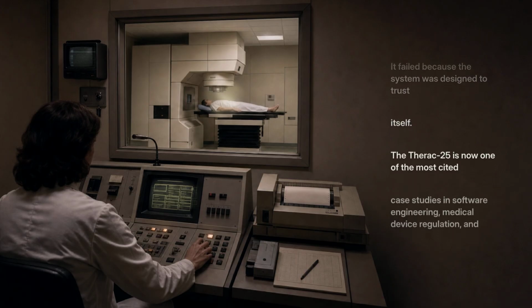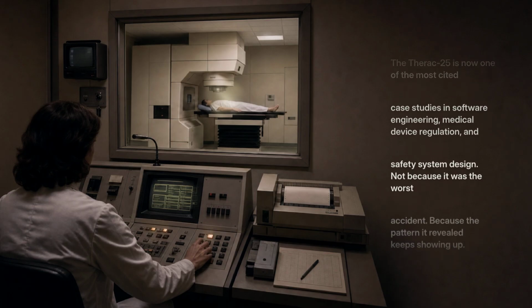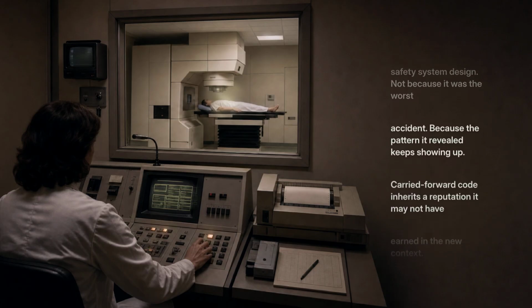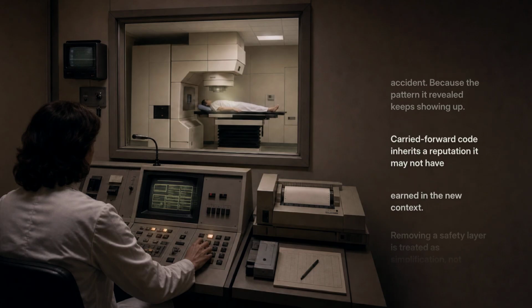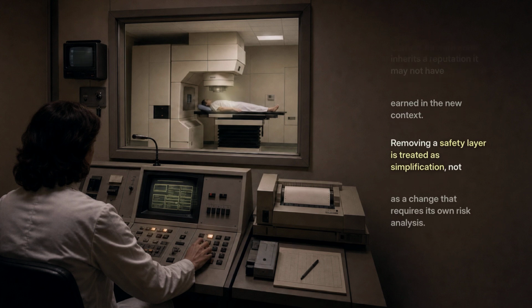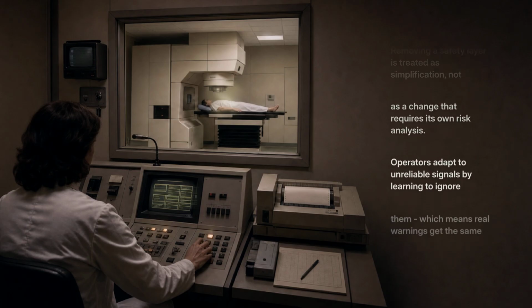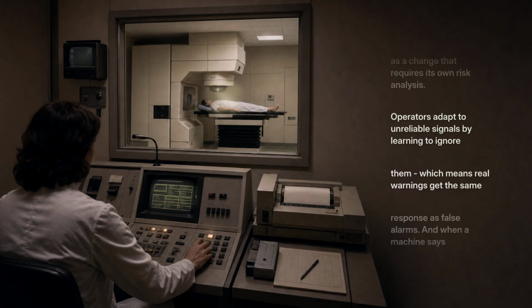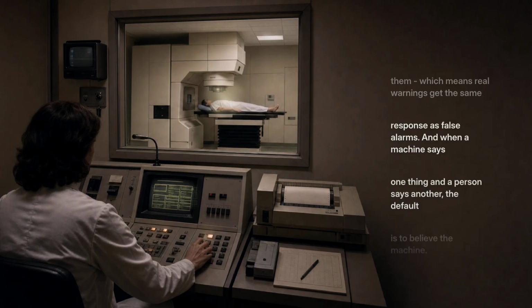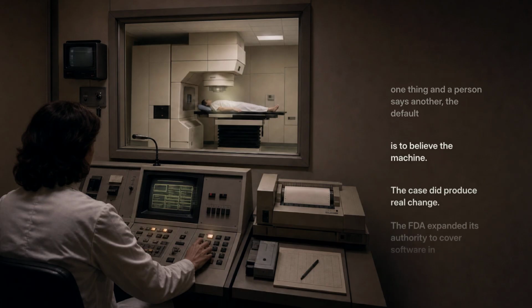The Therac-25 is now one of the most cited case studies in software engineering, medical device regulation, and safety system design. Not because it was the worst accident, but because the pattern it revealed keeps showing up. Carried forward code inherits a reputation it may not have earned in the new context. Removing a safety layer is treated as simplification, not as a change that requires its own risk analysis. Operators adapt to unreliable signals by learning to ignore them, which means real warnings get the same response as false alarms. And when a machine says one thing and a person says another, the default is to believe the machine.